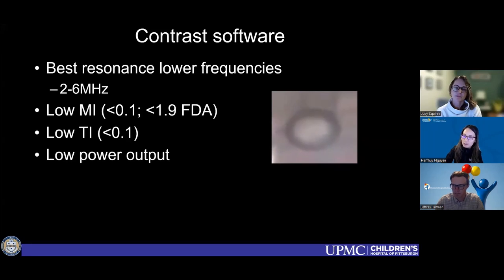So yeah, to your point, I don't know if I used a curved probe, would the bowel enhance more than with the linear. But usually with liver lesions, I tend to stick with the curve.